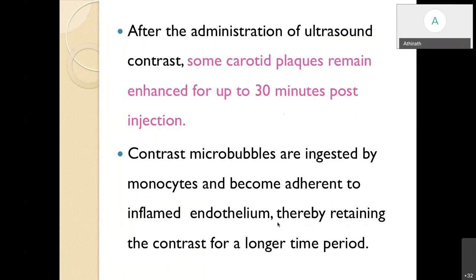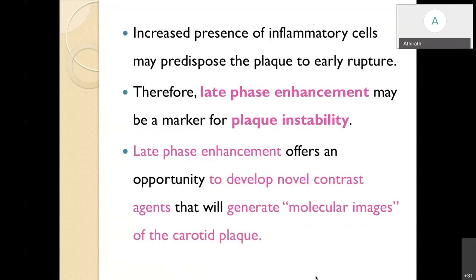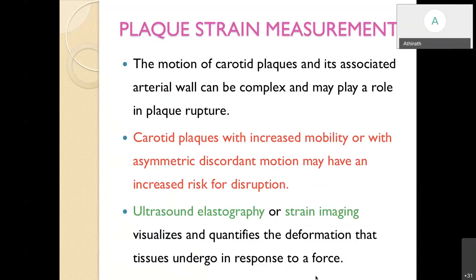So these microbubbles will be ingested by these monocytes. And as it is an inflammatory plaque, these monocytes will adhere to the inflamed endothelium, which retains the contrast for a longer time period. Therefore, increased presence of inflammatory cells will result in late phase enhancement, which suggests plaque instability. But the late phase enhancement offers an opportunity to develop novel contrast agents that will generate molecular images of the carotid plaque. Coming to the next topic, that is plaque strain measurement.